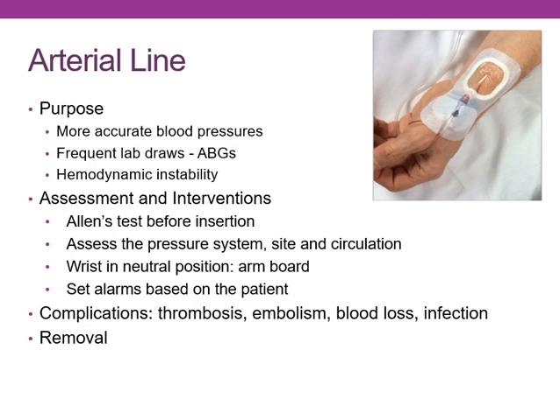The wrist, after this is done, we are going to put a dressing on it. Look at this and tell me what's missing. What's missing is a biopatch. So we can have the biopatch itself, or we are now seeing clear occlusive dressings. I always call them Tegaderm. I know it's a brand name, but that's just what I've gotten used to, that actually have the chlorhexidine patch on them.